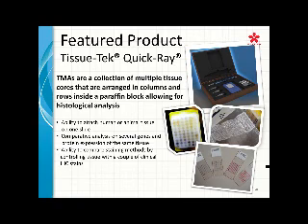Most laboratories are going to have them pre-cut, but ones that have been cut for 1 or 2 years, generally you shouldn't use those for controls. If you're going to pre-cut them, they should maybe be pre-cut a week or two ahead of time, but not actually cutting a ton of slides and letting them sit for a long period of time.